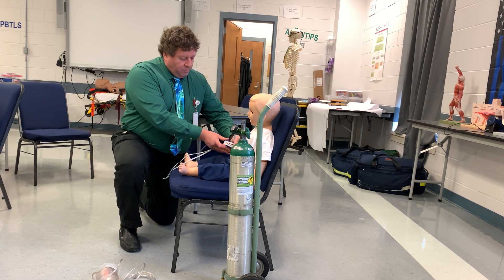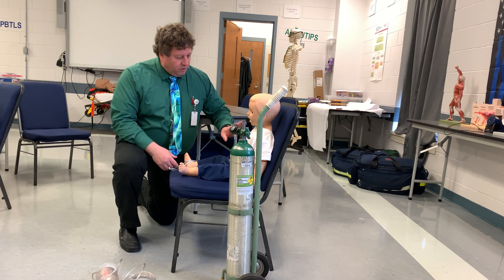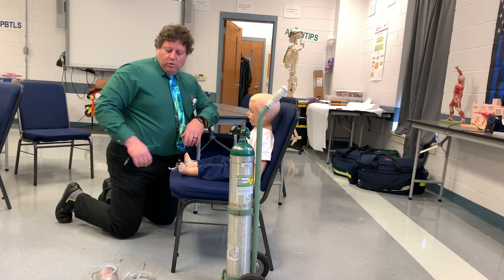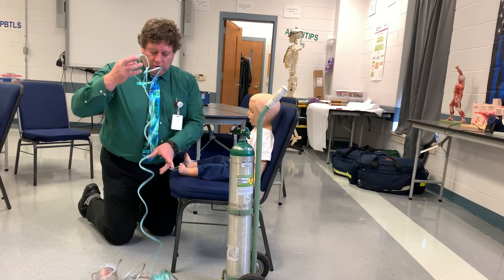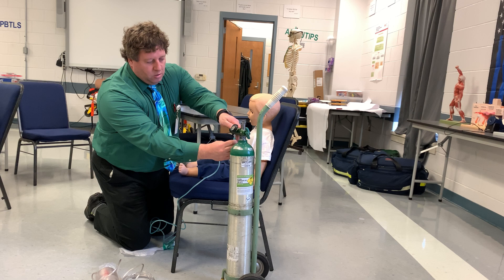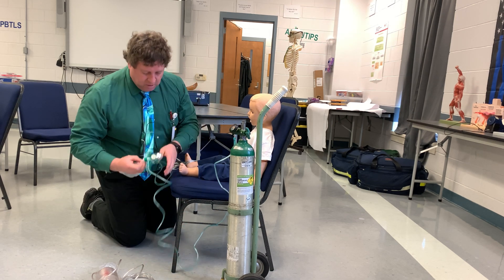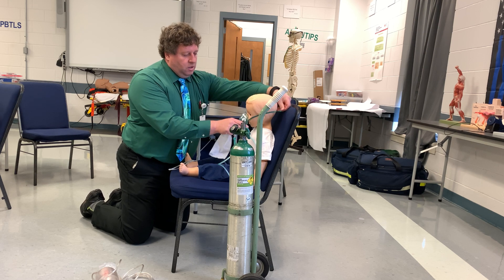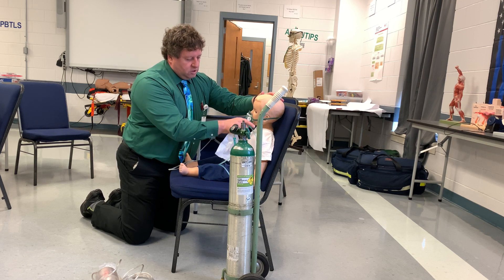I'll put him on my pulse ox and count his respiratory rate. I see his pulse ox is 82%. So at this point, I'm going to put him on some oxygen — get a non-rebreather mask, hook that up to 10 to 15 liters, make sure it's inflated, and give him the mask and the oxygen.